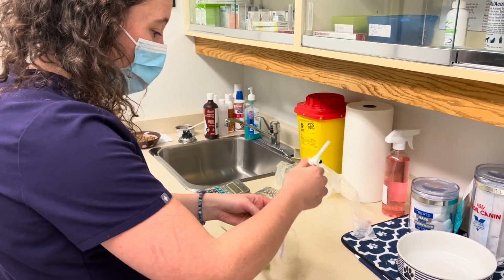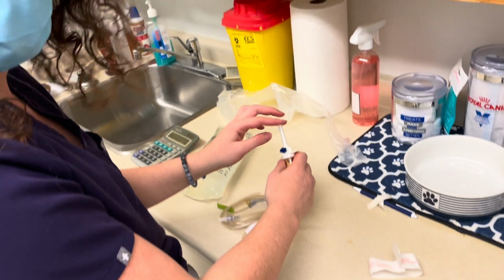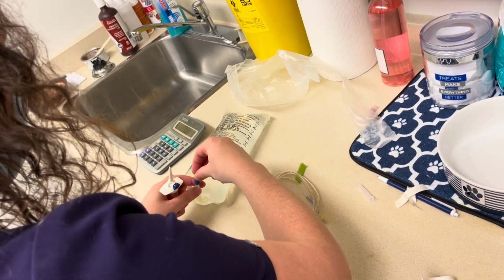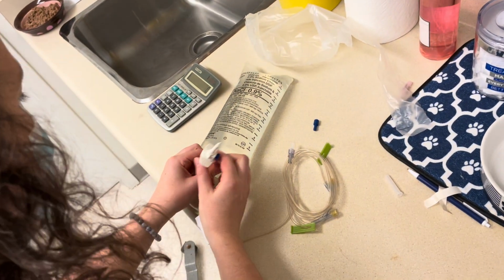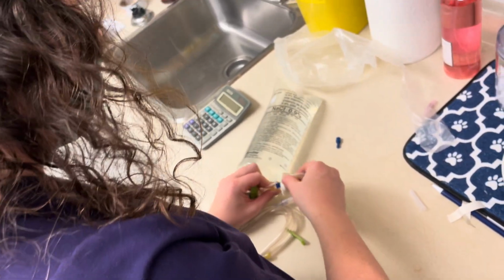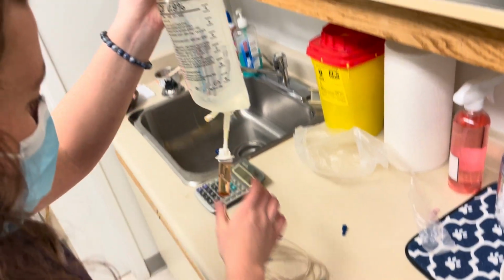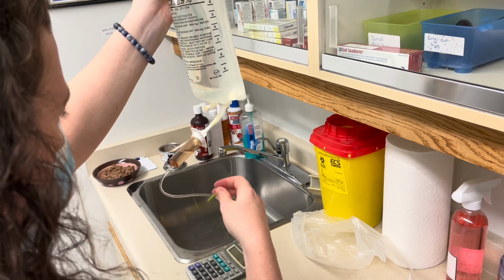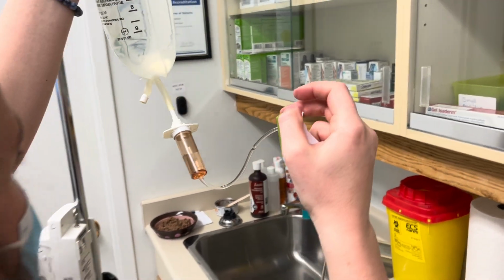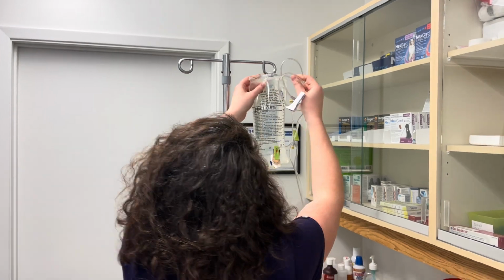So now what we need to do is we need to just disconnect this part of our set here, and we're going to take this, which is our spike and our spike cover. And so I'm going to start by taking my spike cover off like this, setting it right there, and then taking this off, and then just connecting the spike to my bag, like this. So my spike is now connected to my bag, which is great. And then this will run down this way. So I need to set this up here, but first turning this down, and then we look for a line. This one doesn't have a line, but we're about half full, which should be good, so we're able to see where the drips are coming from. And then we just poke the top of the bag here.